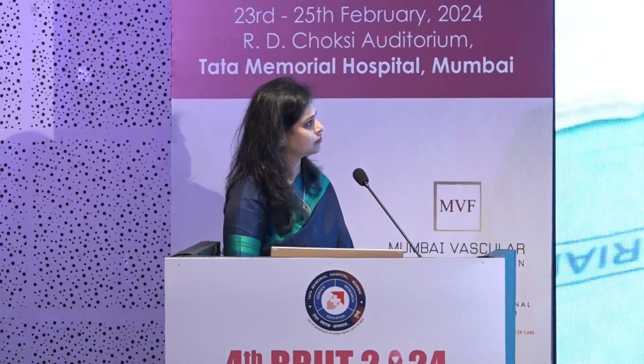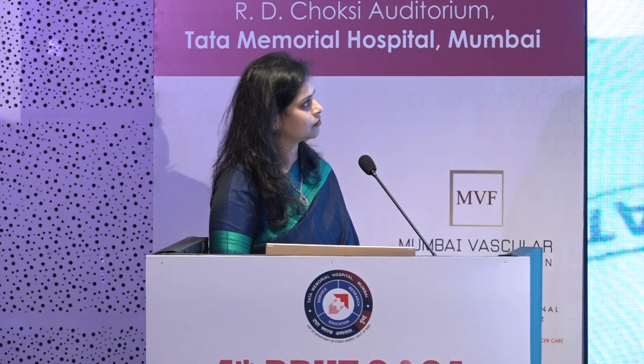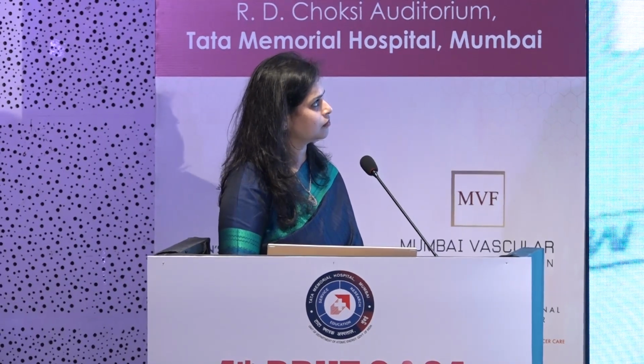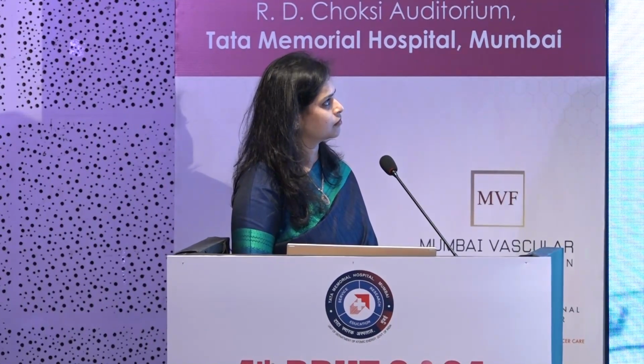So now when I'm inside, since we cannot take an image once you're in the MRI, this is the grid in the lateral position, 1, 2, 3, 4. D4 is where the fiducial, or the CC marker, was. I will go 1 towards the chest wall, 1 inferiorly, and I will be going inside in this position, and I will fix this.